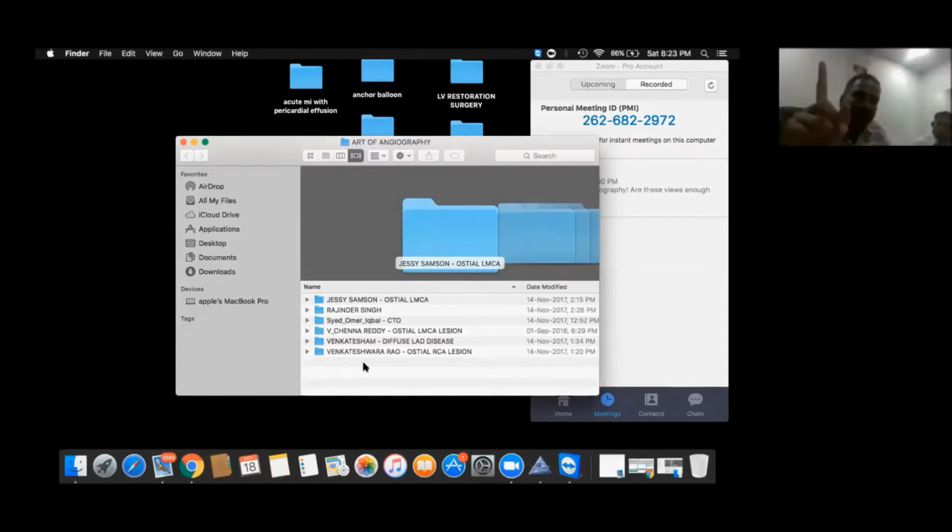Right? So this is how, by observing your native vessel angiogram, you can say whether the graft is there or not. If it is not there, is there any CTO in the grafted vessel? All these conclusions can be made. Based on that, you can use more and more contrast to explore. If there is no to and fro movement, you can stop exploring further also, provided you are sure it is not a total occlusion in that vessel. Hope you all understood my point.